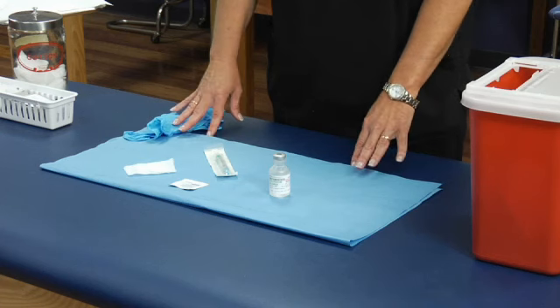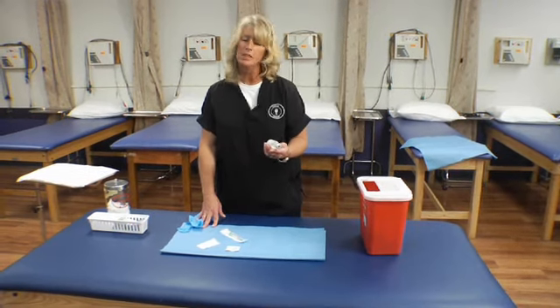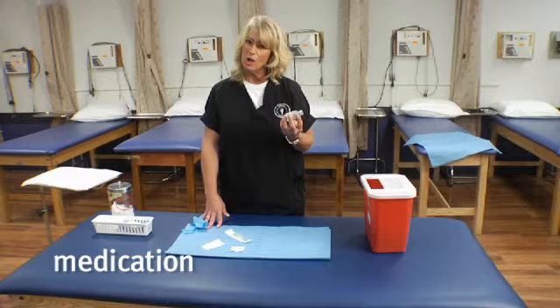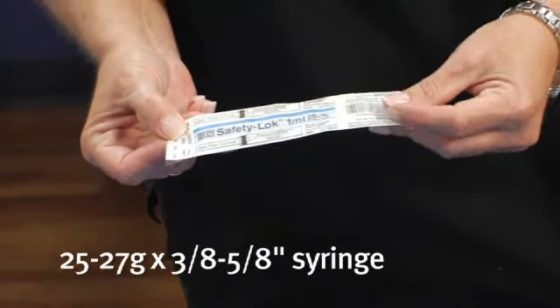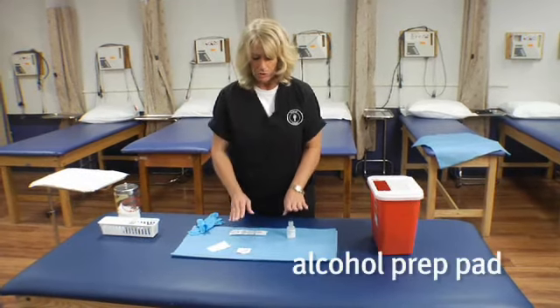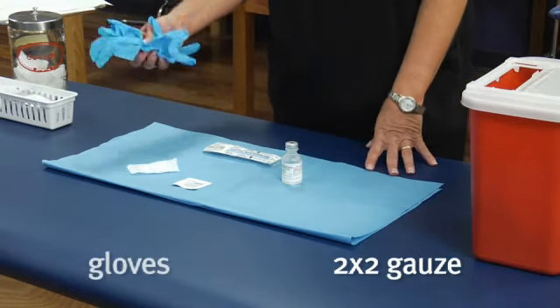These are the supplies needed for our intradermal injection. For teaching purposes we inject 0.9% sodium chloride — just salt water. We use a 1 mL, 25-gauge, 5/8-inch needle for the intradermal. We also need an alcohol prep to swipe our vial, 2x2s, and gloves.